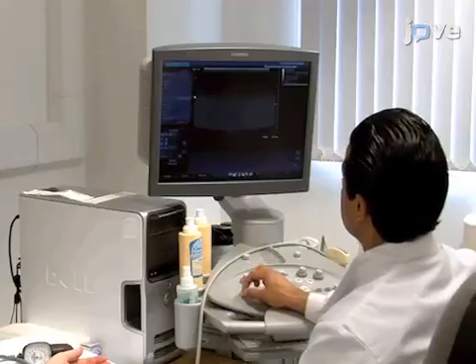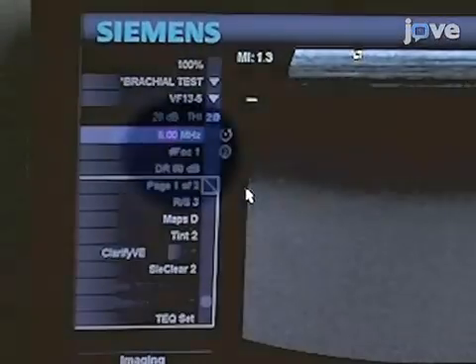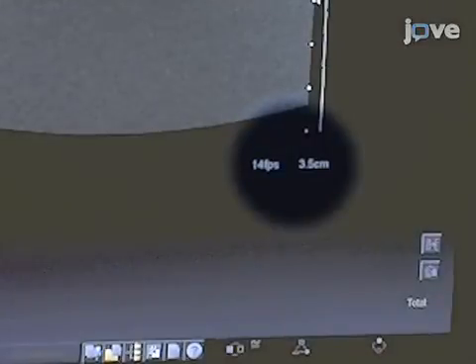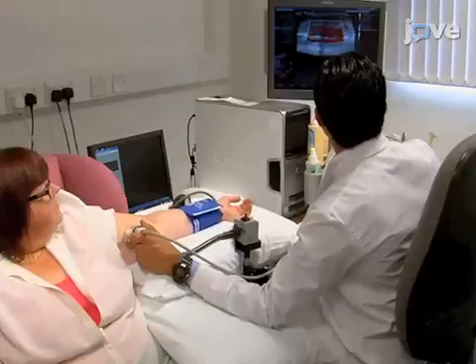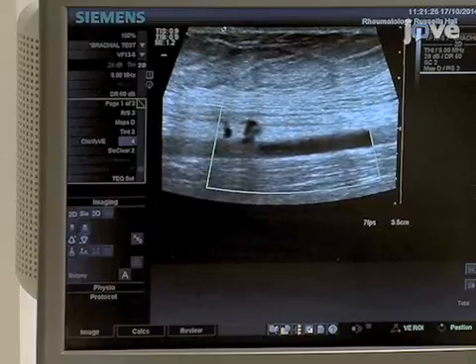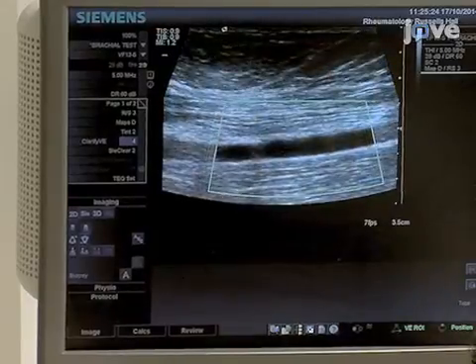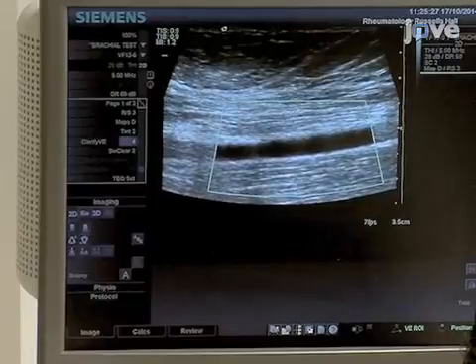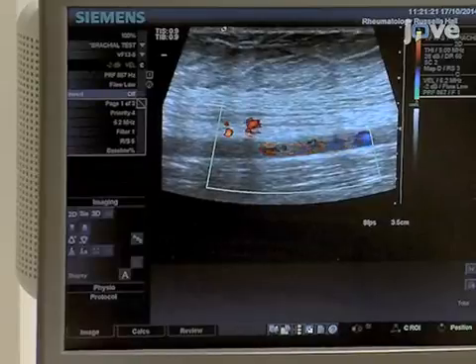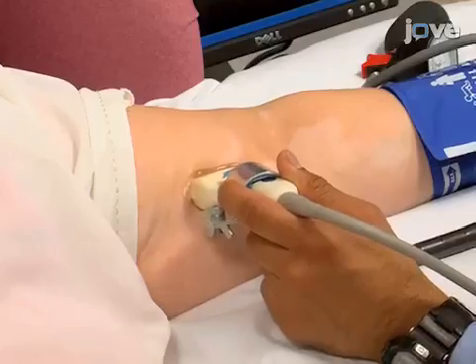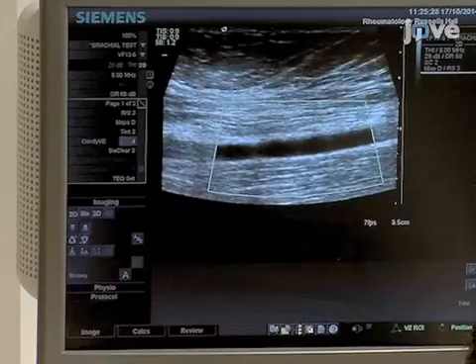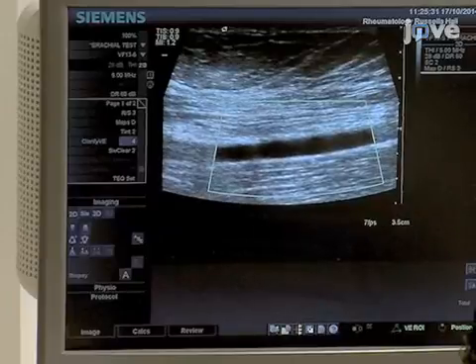Next, access the menu on the ultrasound machine. Set the scanning frequency to 5 MHz and set the depth to about 3.5 cm. Now, using the transducer, locate the brachial artery with longitudinal scanning — it is usually 2 to 10 cm above the antecubital fossa. Then set the gain for a symmetrical brightness in the near and far wall of the vessel. Color Doppler will show the arterial blood pulsing through the artery, which will distinguish it from any veins. Set the view of the brachial artery so it is clearly seen and horizontal on the screen, appearing as two solid parallel lines separated by a clear area.